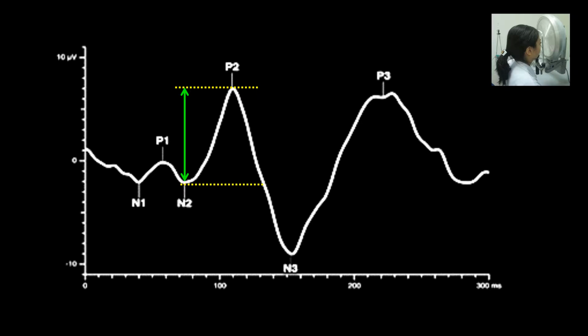The recommendation made by some neurophysiologists and ophthalmologists is to call amplitude statistically abnormal if its value is above 97.5% of controls. The clinical relevance of such abnormality has not been defined. Latency is considered by some to be abnormal if the delay is more than 132 milliseconds.